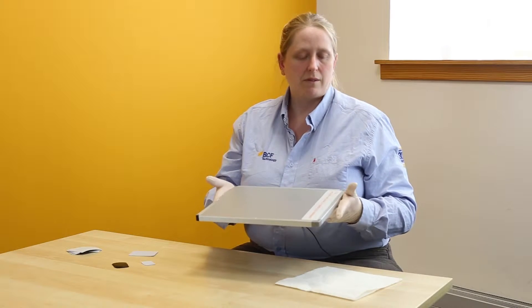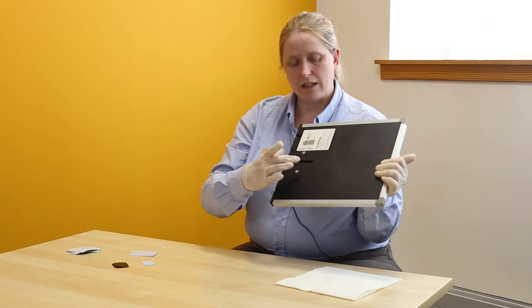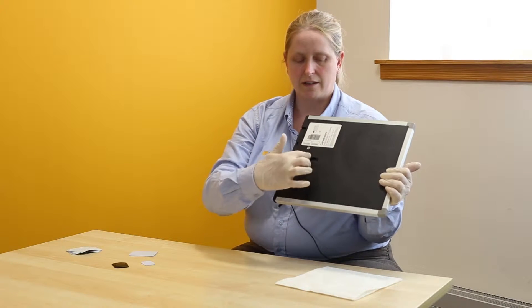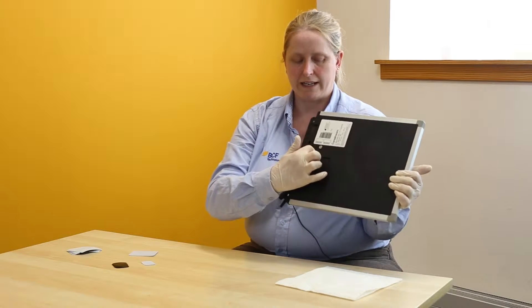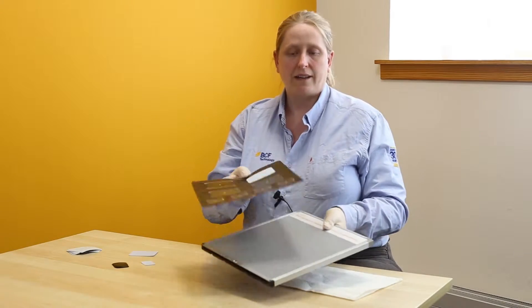Once you have erased it you will have the cassette back and you want to take the screen out. To do this you need to look for the little slider on the underside, pop your finger into there and slide it across to the open end of the cassette, and that gives you back the holder.